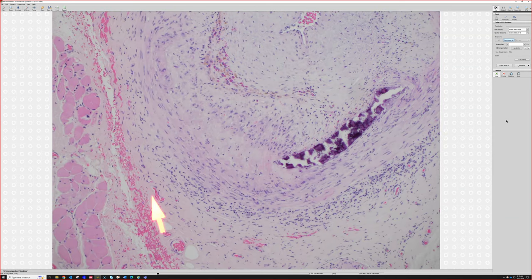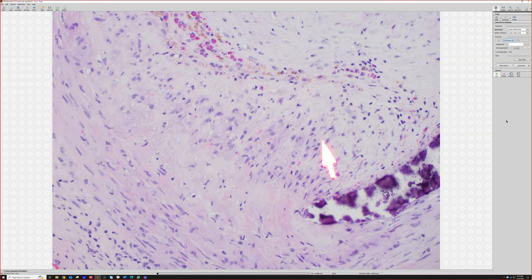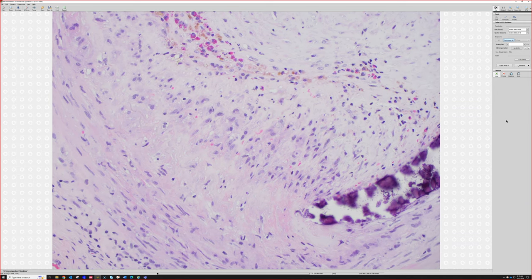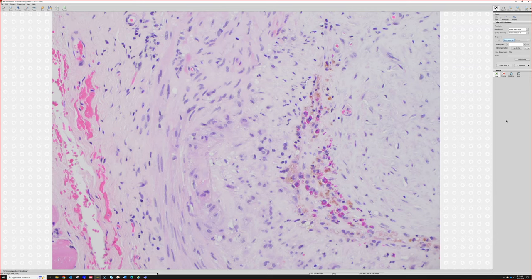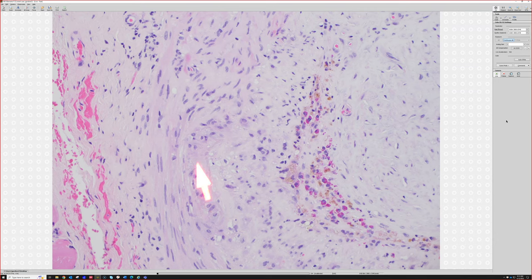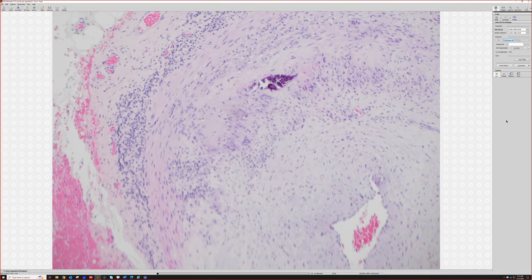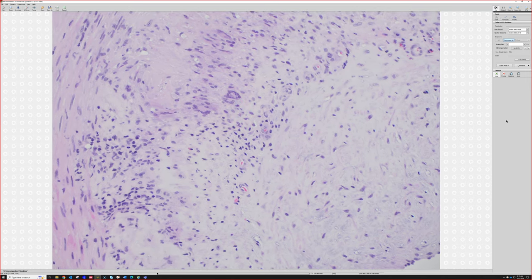We've got the real deal here. Look at all this stuff. These are histiocytes infiltrating the wall of the vessel. There's also been hemorrhage here with hemosiderin. There's some eosinophils here, which is kind of interesting. We see that occasionally. And there are some, not the best example here, but some giant cells in here. There is a better one on another section. There it is. Multinucleated giant cells in the wall of the vessel, and they're usually right around the elastic lamina.